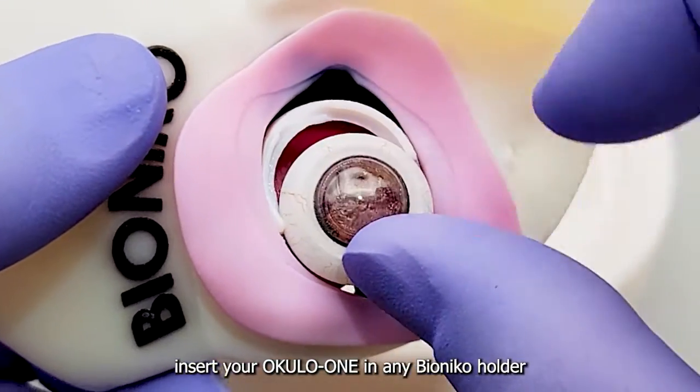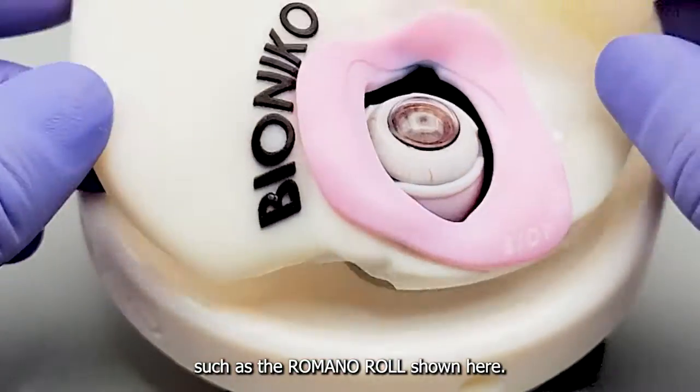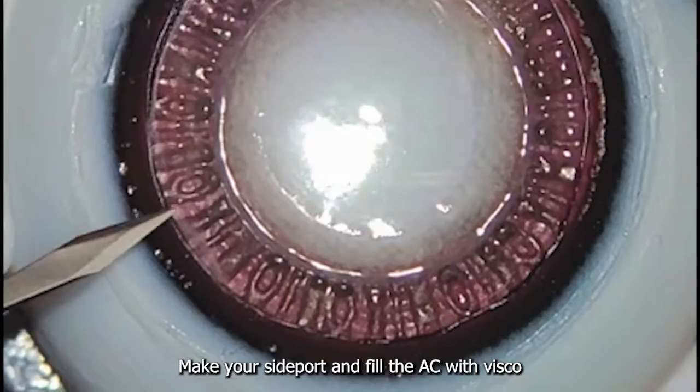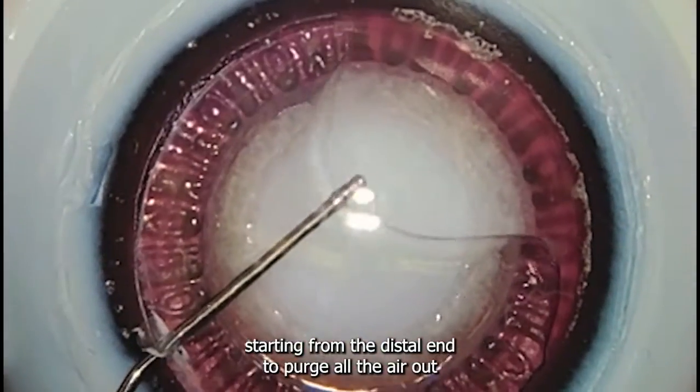To begin, insert your OKULO-ONE in any Bioniko holder, such as the Romano roll shown here. Make your side port and fill the AC with visco, starting from the distal end to purge all the air out.